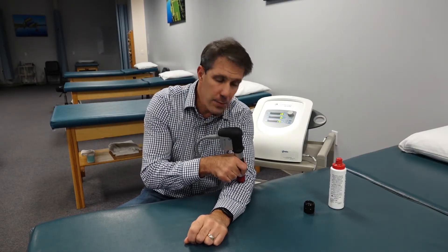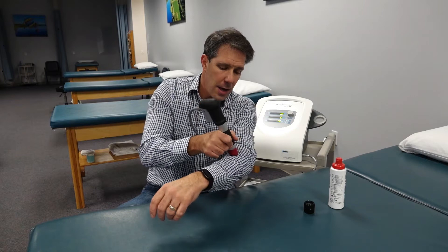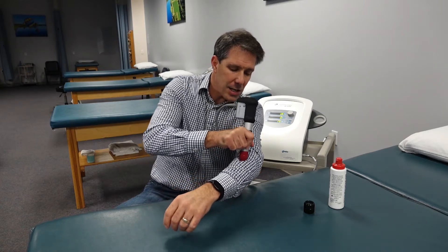One nice thing is that you don't necessarily have to move the head. It's not the same as ultrasound where you have to keep the head moving all the time to get that thermal effect. You can keep the head in one spot and move it side to side.